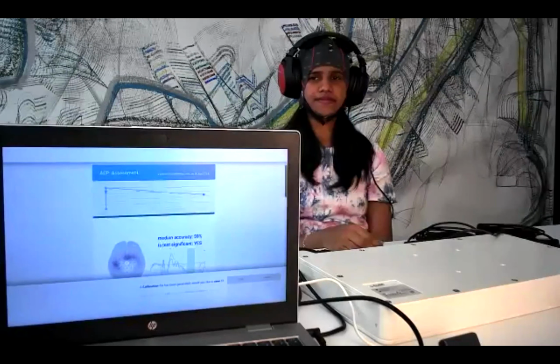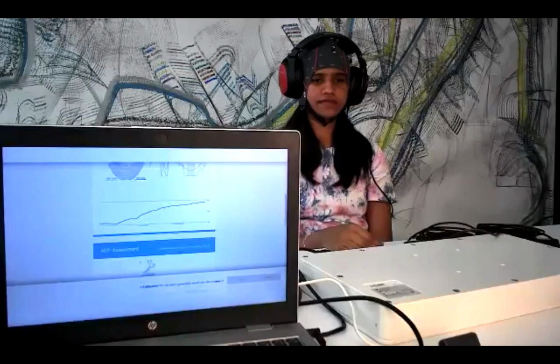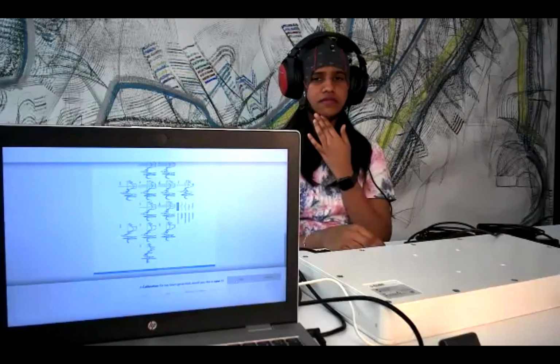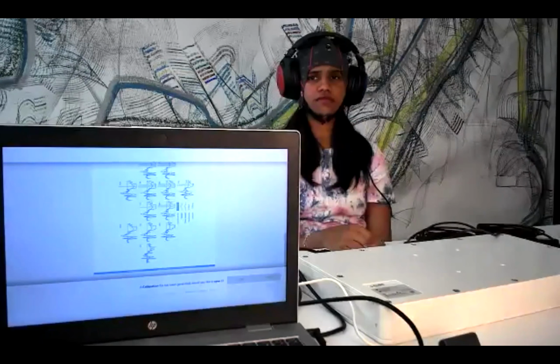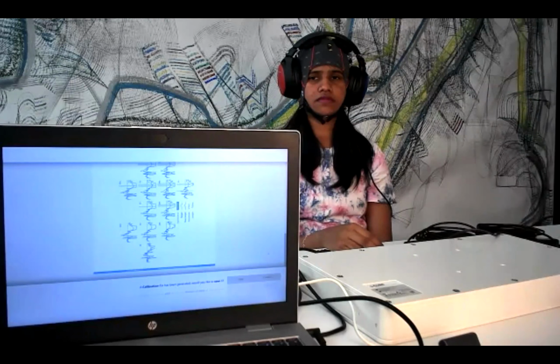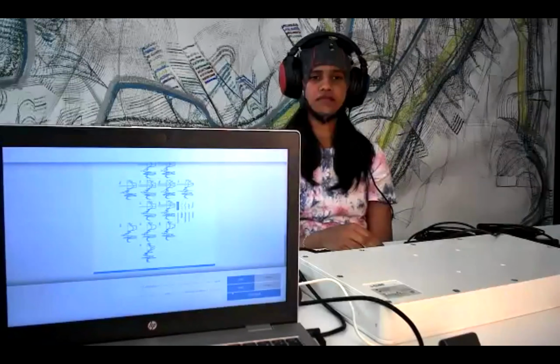So if we look at the results page, we can see the accuracy is actually increasing when we have a large number of averages. Which means the signal to noise ratio might not be the best in this situation. That's why the accuracy is 59, and it's far above the chance level. And it's also a significant result. So I can save the result here and also add the result to the history data.